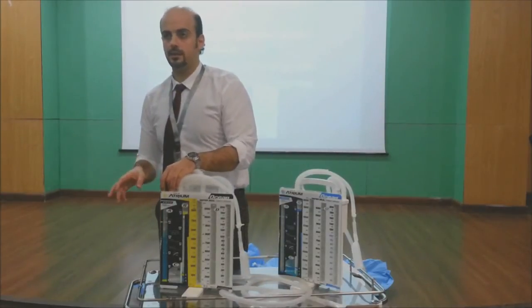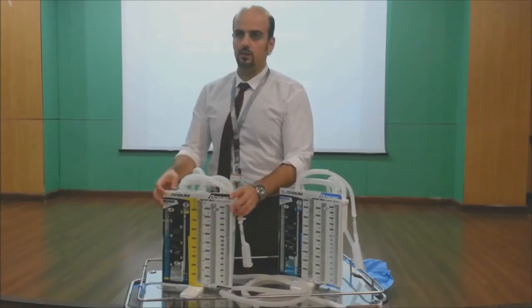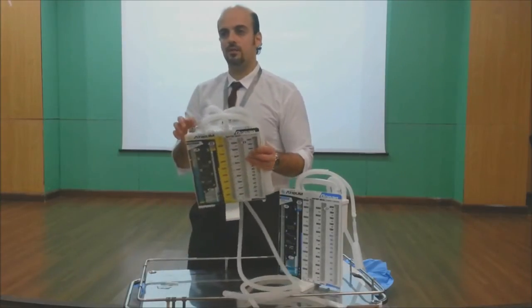No, it's not sterile technique at all. It's clean only. Don't forget to cover the seal again.